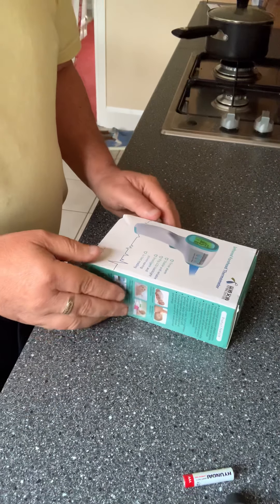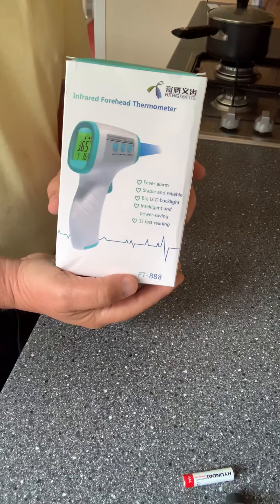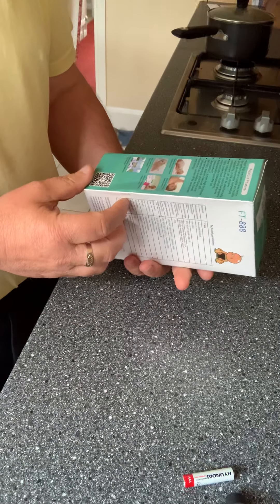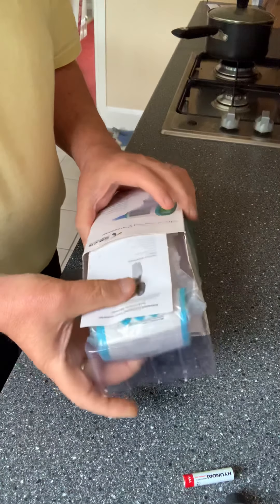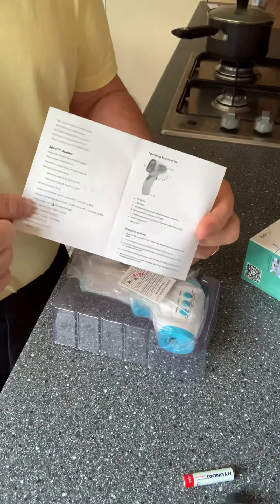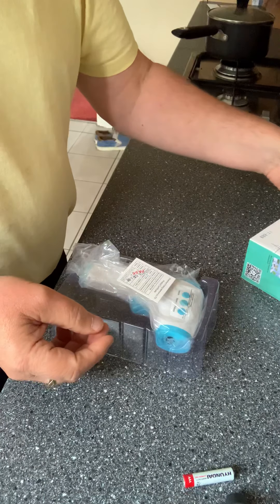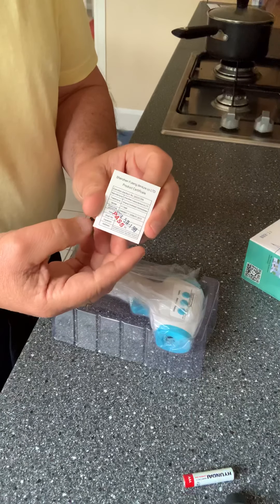I received this today — an infrared forehead thermometer. It took a few days to come in the post but I'm quite impressed. It comes with an instruction leaflet; you need to scan it to enlarge it because the writing is quite small, and a little certificate to say that it's been tested.